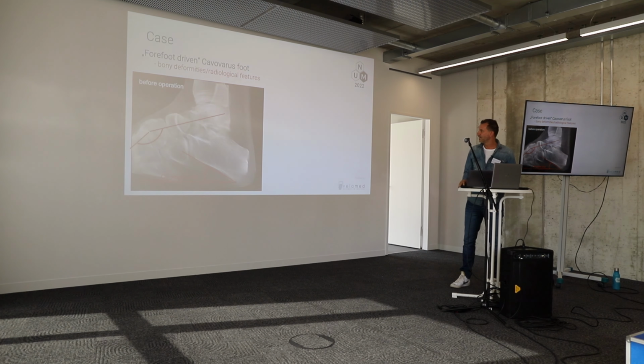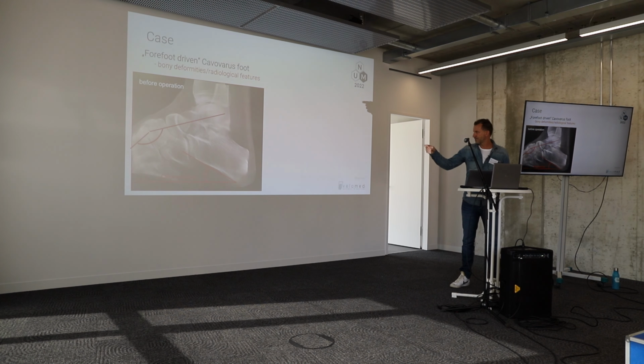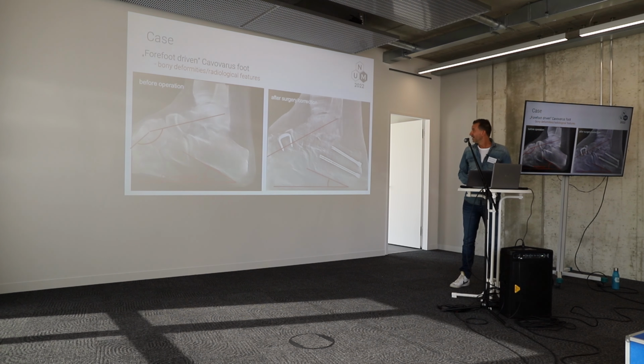pathological. And you have the calcaneal pitch, which is the angle between the lower ground of the calcaneus and the floor. And after the operation, you see that the calcaneus comes down a bit, and that you have a straight line from the first ray to the longitudinal axis of the talus.